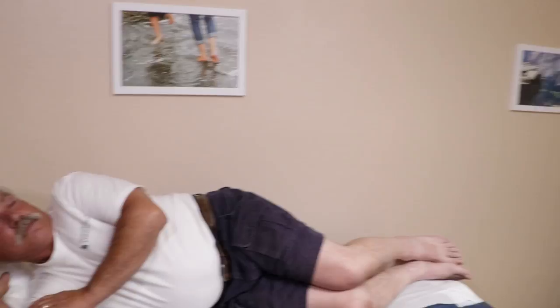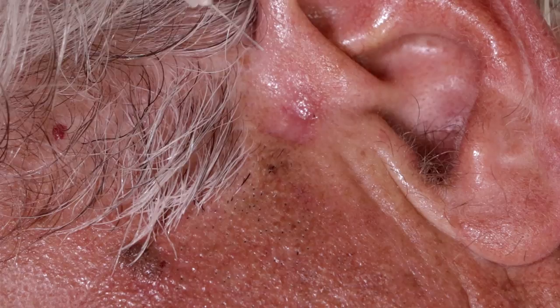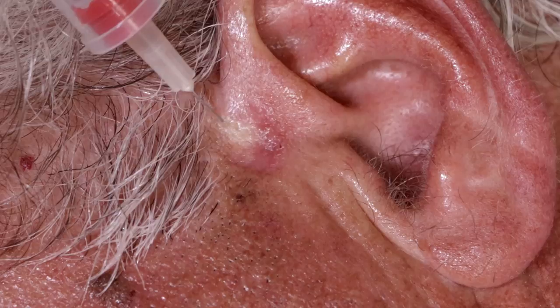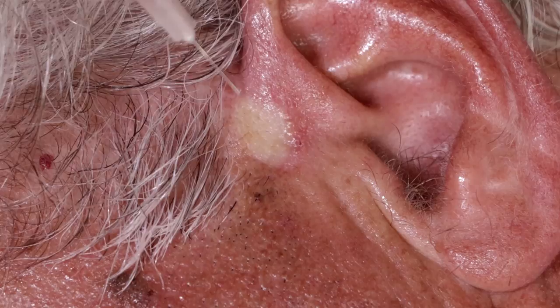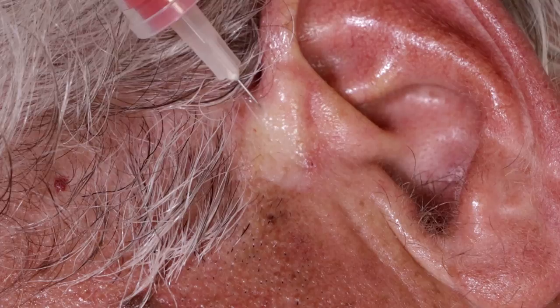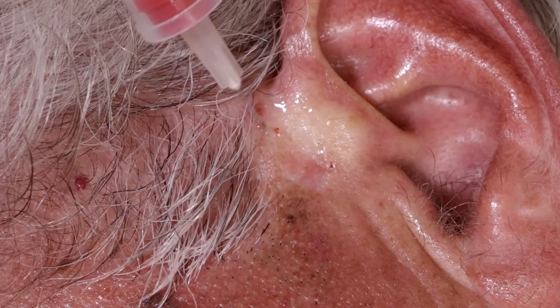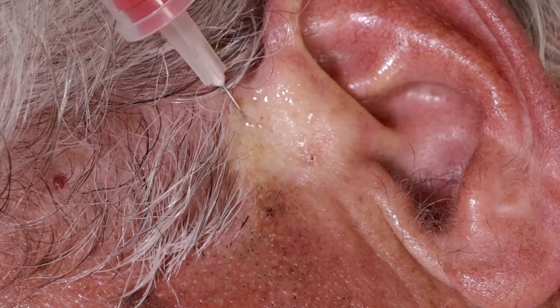Alright, this is the part where we numb it up — somebody get the wrench, the big crescent wrench. We're getting this entire area ready. I'm putting in some anesthetic — lidocaine 1% with a little bit of buffer — and I'm going to numb up quite a broad area here. I don't want to go too much in the ear because I am using epinephrine, but we do want to get all the area that the curette takes off.